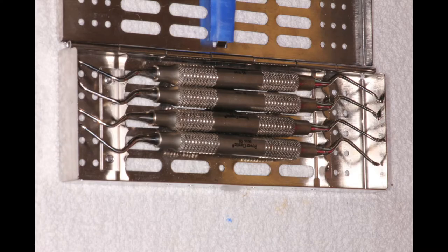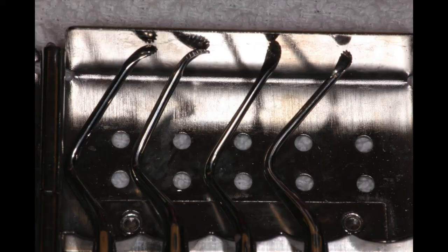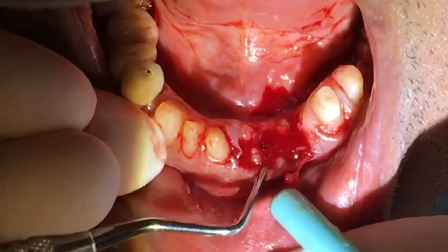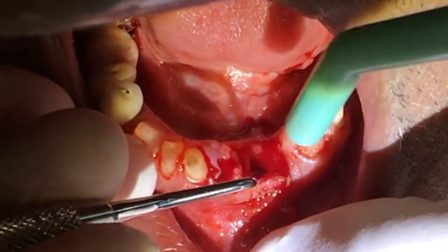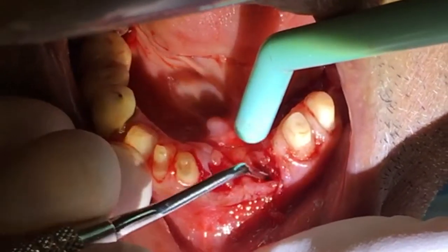The curettes actually have serrated edges on them to clean out all of that debris that was inside there. That probably took a good seven or eight minutes of scraping just to get that soft tissue out, to allow the socket to heal the best way it possibly can.